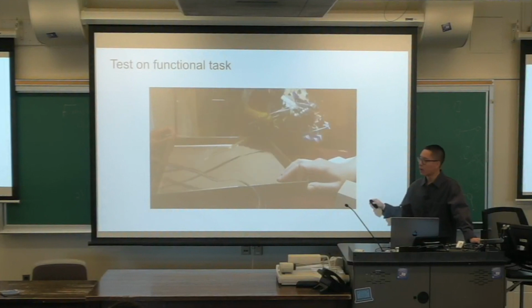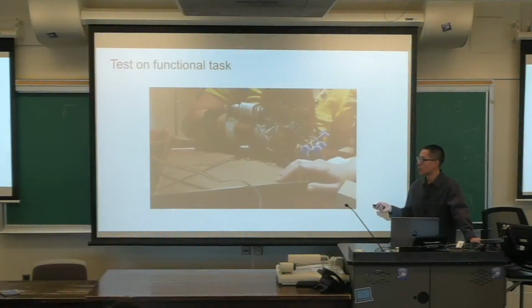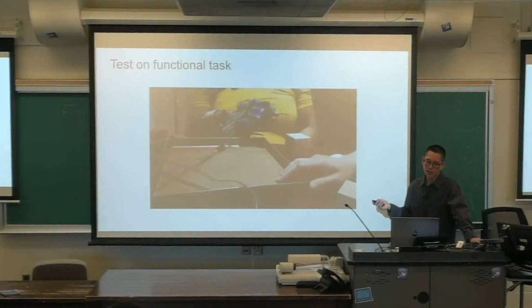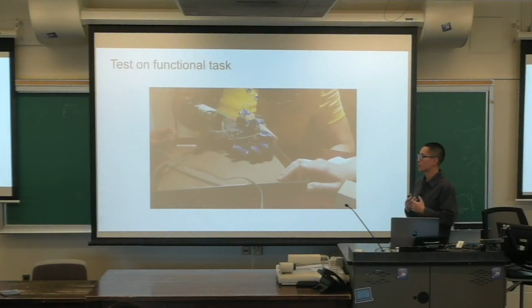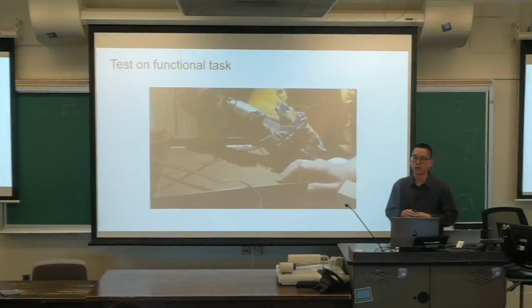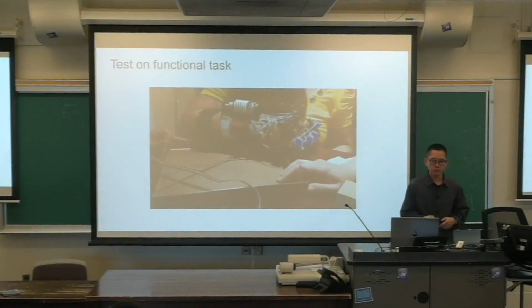This is good, but at the same time, there are some problems with this. You can see there's clearly some delay, and she has to try a couple of times before the device actually opens or closes as she intends. But we're getting there.